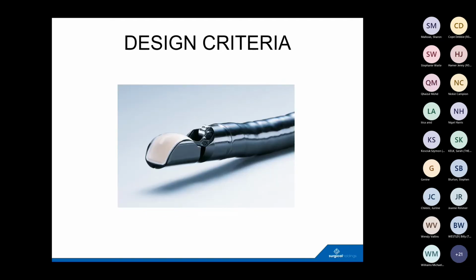This is an example of an endoscopic ultrasound scope. This is the ultrasound transducer, in this case what's known as a curvilinear transducer. That emits sound in that plane into the tissues, and then you have the optical system, and this is for fine needle aspiration. So you have a needle that comes into that plane, and you're imaging where the needle goes to your area of interest, and you take samples of cells with fine needle aspiration.